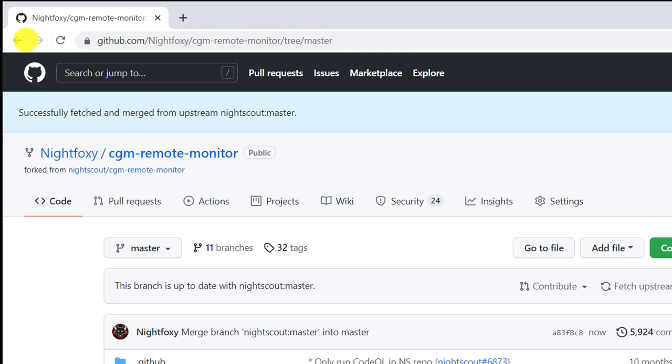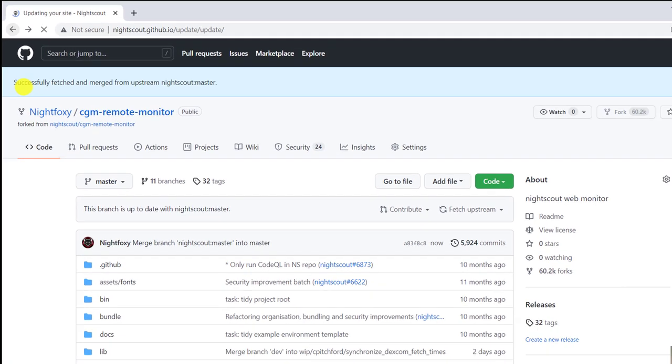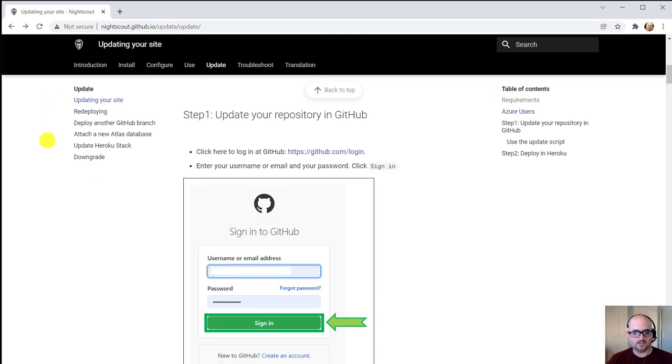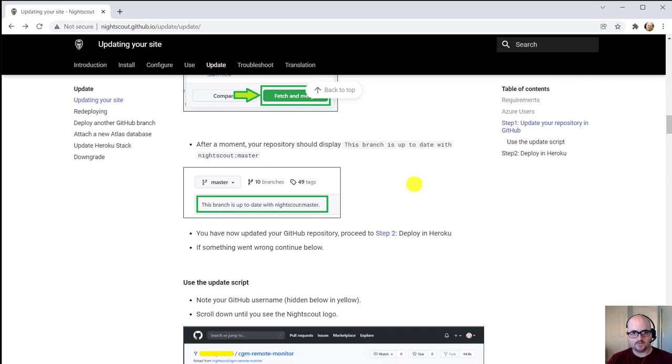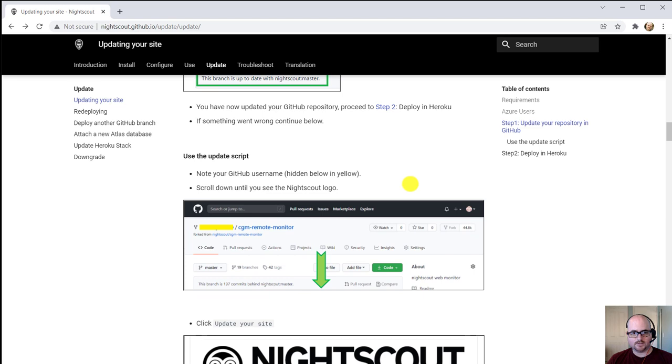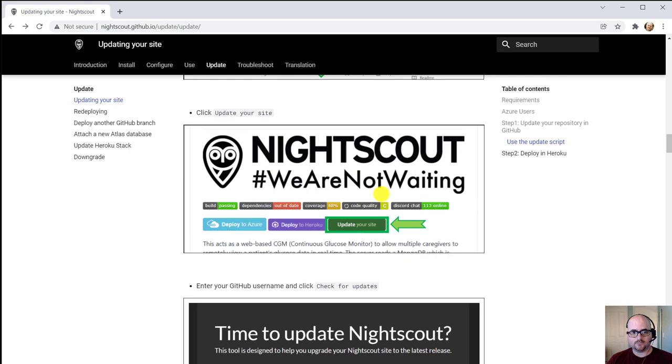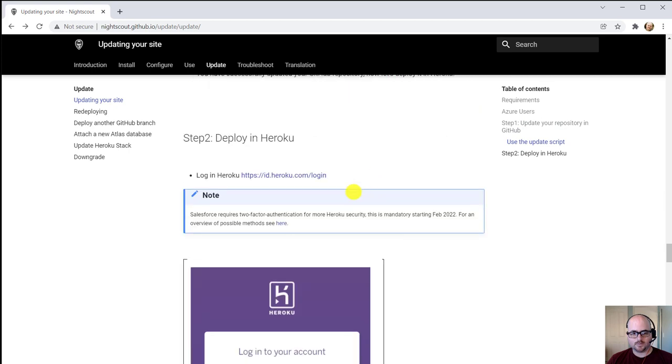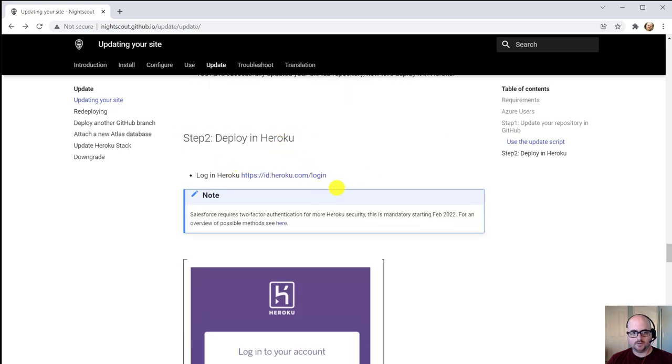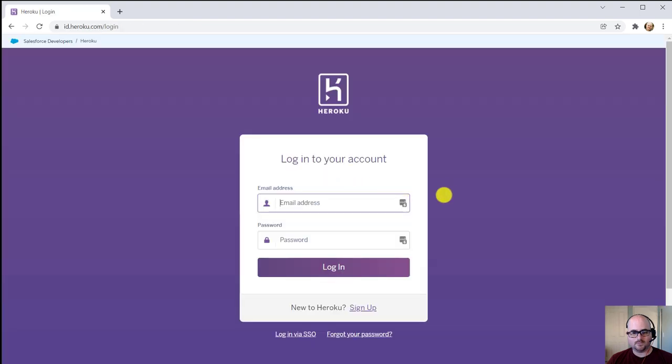Now we can go back to the update page. As you go down, you'll see there's another option here that says Use Update Script. We're going to skip that. Go down further to where it says Step 2, Deploy in Heroku. Now we're going to follow this link, and this will log you into Heroku.